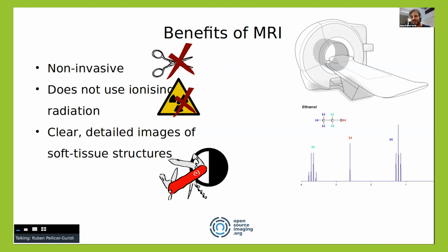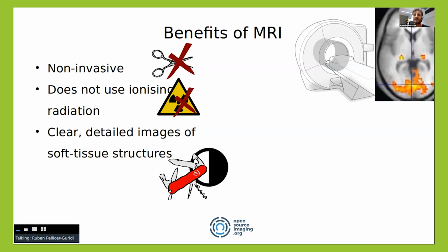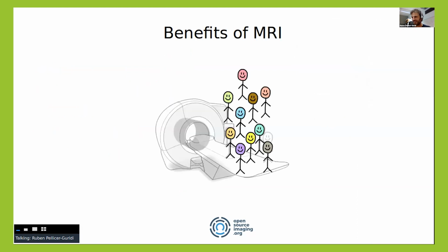And besides that, there is the big brother of MRI, that is the NMR, nuclear magnetic resonance spectroscopy, that is incredibly informative, and more exotic imaging like functional images of dynamic movements of tissues and thoughts in the brain. What is the problem?